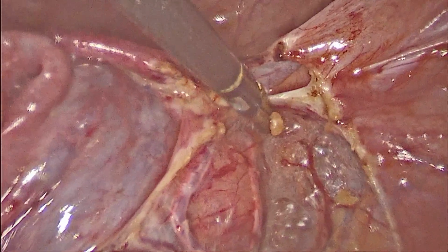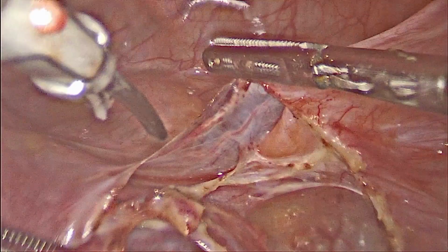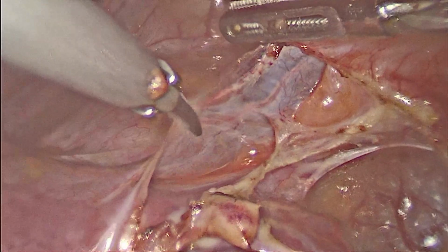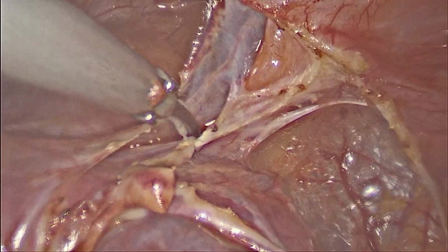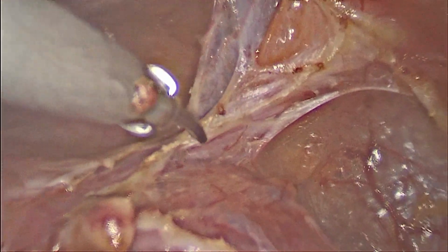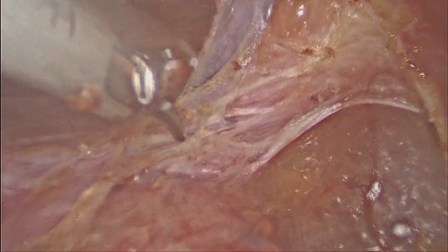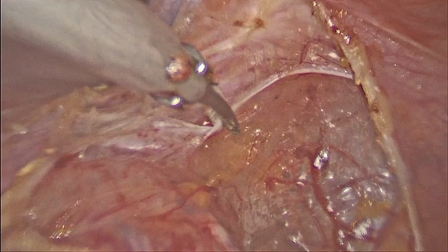So this is not the uterovesical fold of peritoneum. This is an adhesion between the uterus and the lateral pelvic wall. Below this we can see the uterovesical fold of peritoneum. As we are anticipating more adhesions between the bladder and the cervix due to the previous two surgeries, and also inflammation due to the infection, which further increases the fibrosis between these two structures, identifying the planes becomes a little more tough. But if we do a meticulous and slow dissection, it is possible to identify these avascular planes.